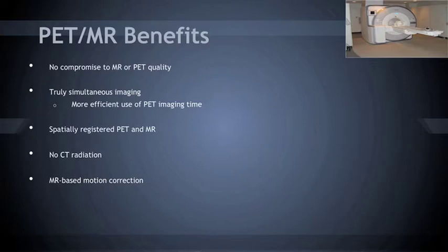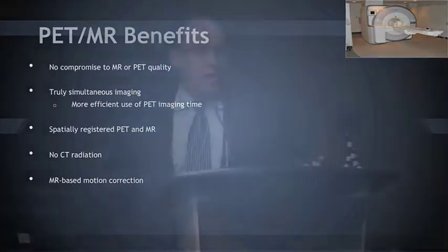When you get a PET CT, you have essentially sequential imaging. You have a PET, and then you have a CT, or it could be reversed in that sequence. So the actual image acquisition of the two modalities is not truly simultaneous. In this PET MRI, it is. The PET detectors are fully integrated into the system. It uses a semiconductor detector, which is not unique, but it's very early in development, at least in PET imaging, as opposed to typical photomultiplier tubes, which are used in conventional PET.